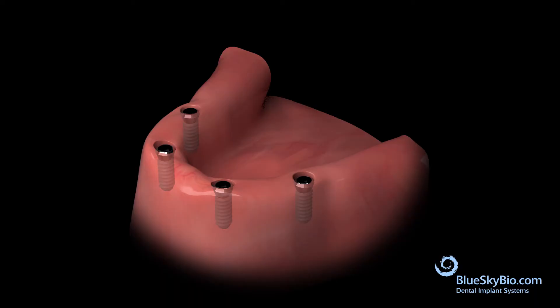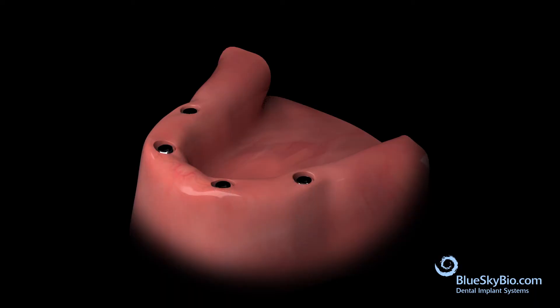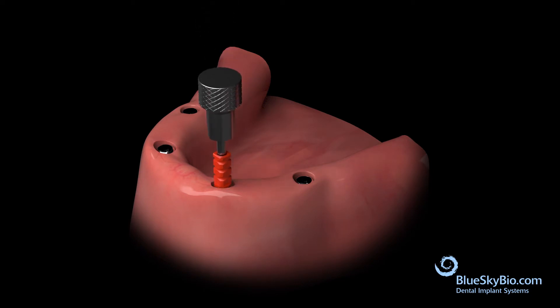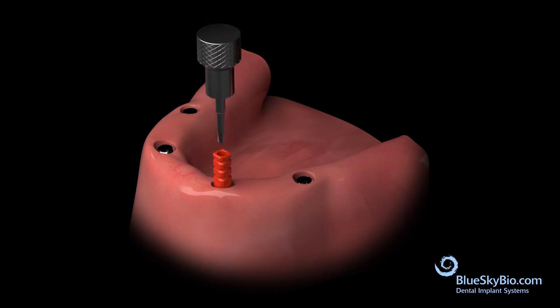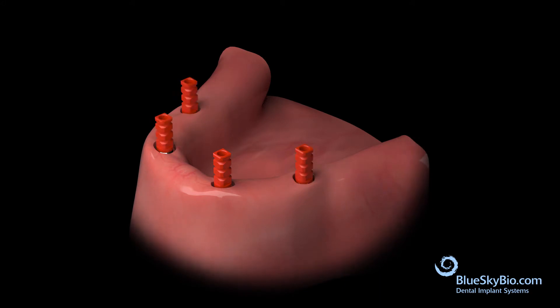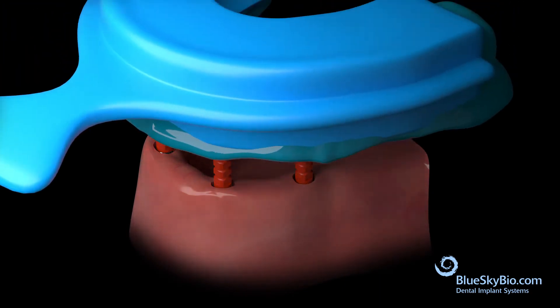Mandibular arch with four implants in place. Impression transfers are placed on all four implants. An impression is taken.